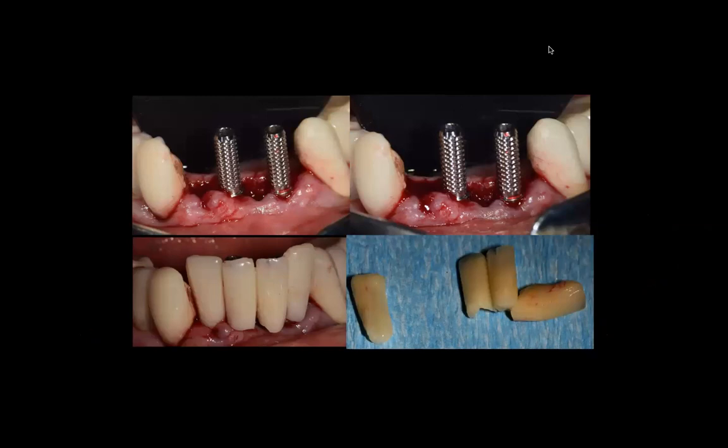Now, even in cases like this where I have to make a prep on these cylinders, I go ahead and do it outside the patient's mouth. I mark, and then I come outside and do the adjustment. But I want to bring your attention to the temporary. Look what happened to my temporary. Isn't that amazing?